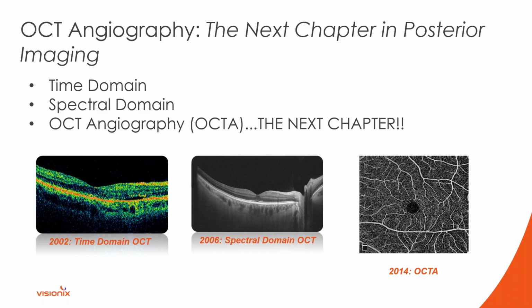And so a couple of years later, again, the company said, we got to do something, we got to do better. And so that's when OCTA was introduced. And OCTA essentially is the optometrist or the retinal specialist or the general ophthalmologist way of doing an angiography without doing anything invasive. And so what you're visualizing on the right-hand side of the screen there is what the angiogram essentially is going to look like. And it looks different than the OCT scan because you're visualizing vasculature.